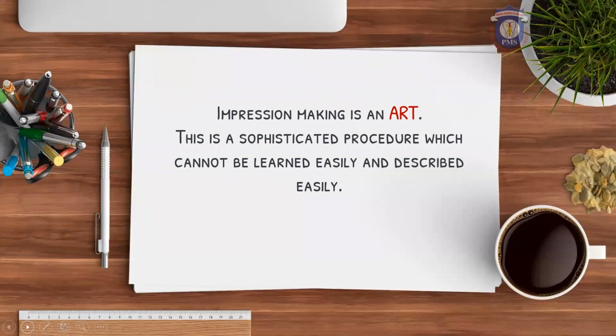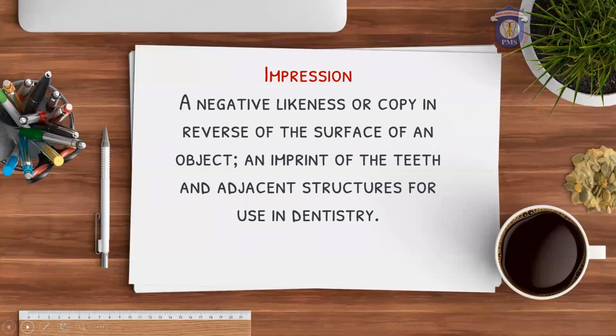Impression making is an art. This is a sophisticated procedure which cannot be learned easily and described easily. Impression: a negative likeness or copy in reverse of the surface of an object; an impression of the teeth and adjacent structures for use in dentistry. Glossary of Prosthodontic Terms, edition 9.